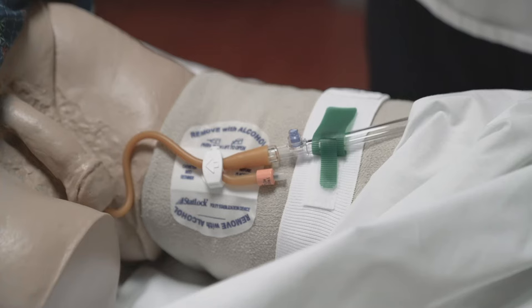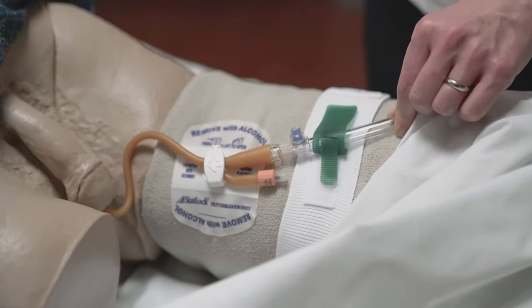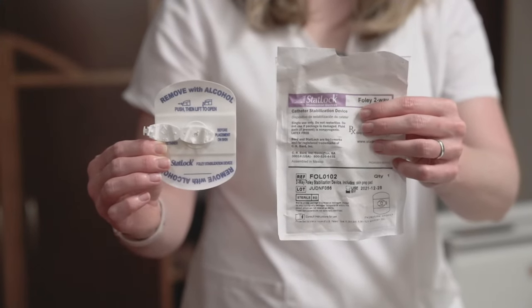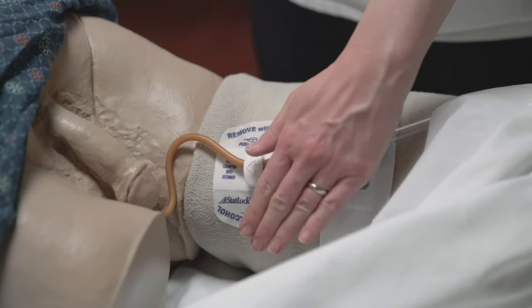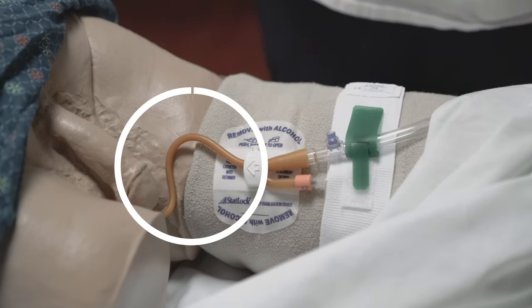While the Foley catheter is in place, the tubing needs to stay close while being securely attached to your leg. You will be sent home with a stat lock or sticker placed on your leg. The sticker should be placed on the upper inner part of the thigh. The tubing from the urethra to the stat lock should be somewhat loose — this will help keep the tubing from getting pulled.